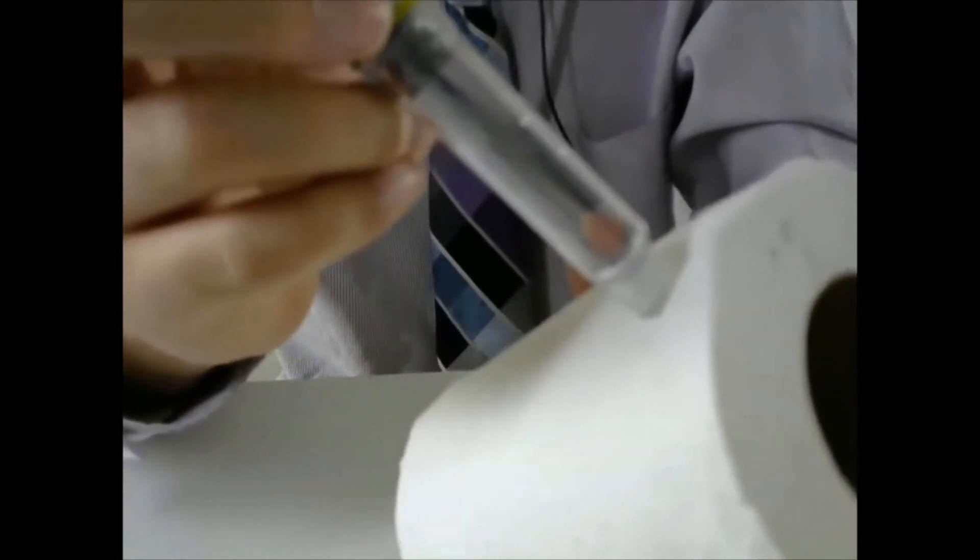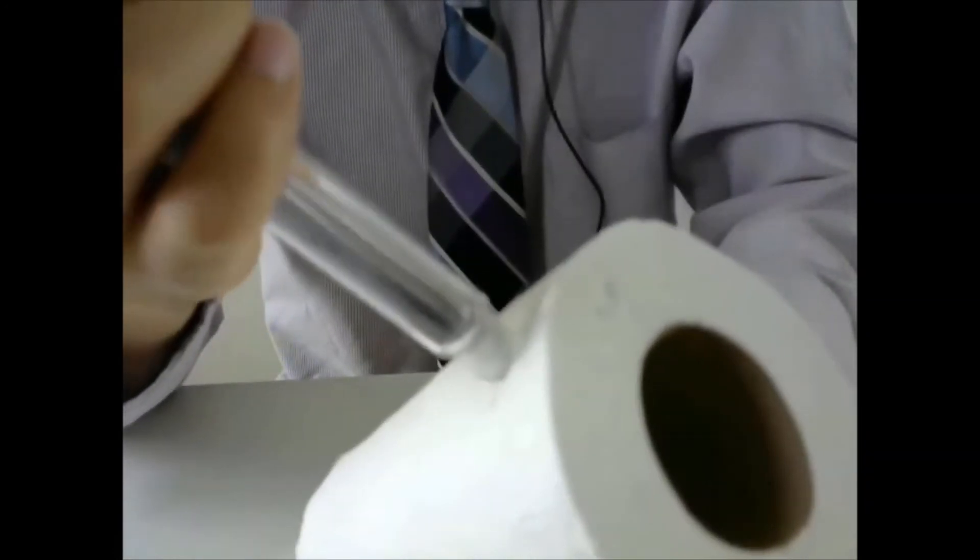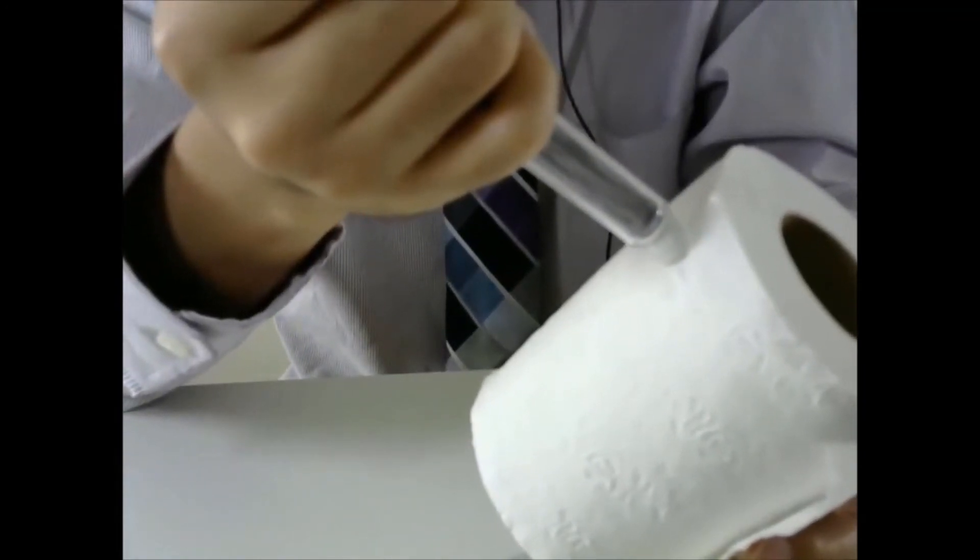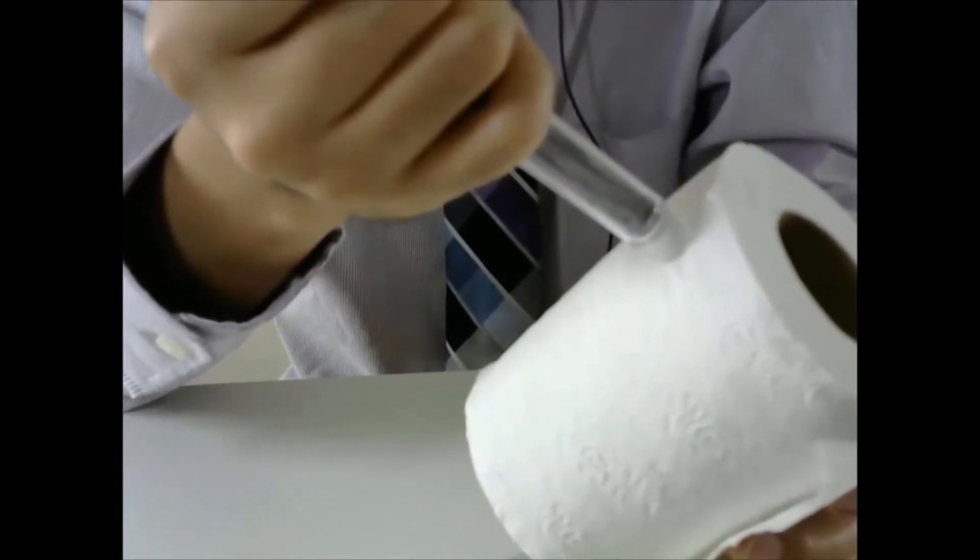Push the needle in and press the button all the way down.